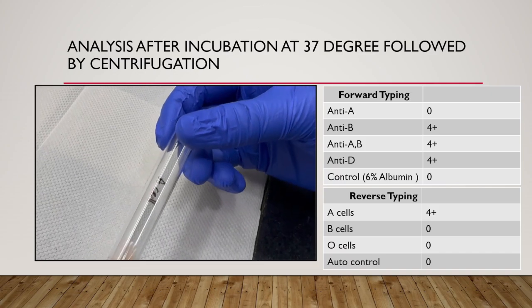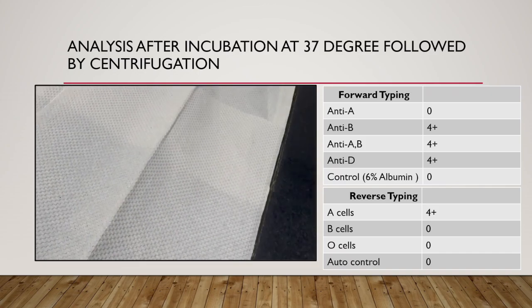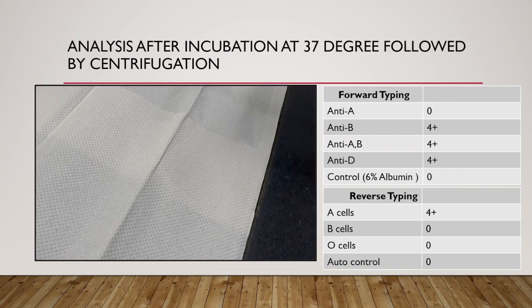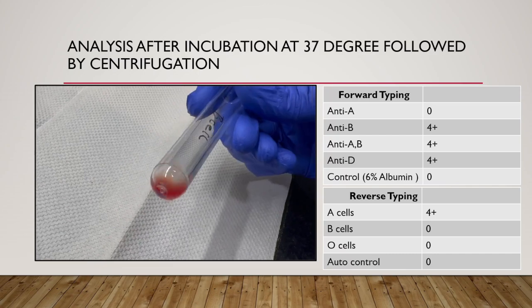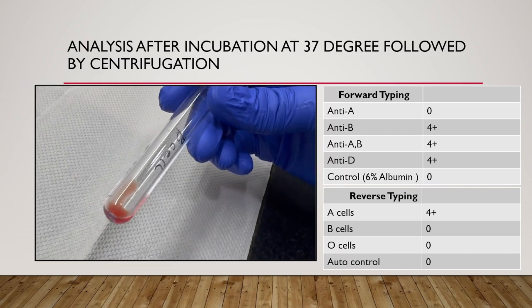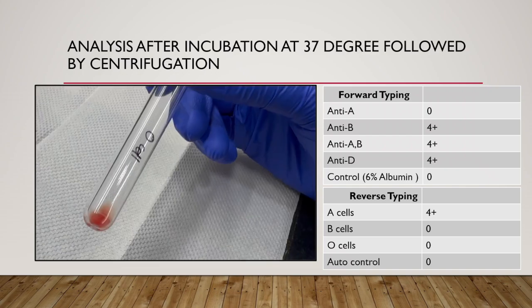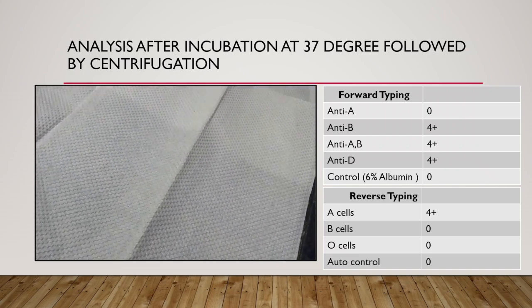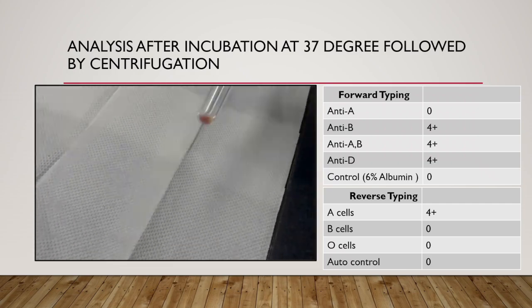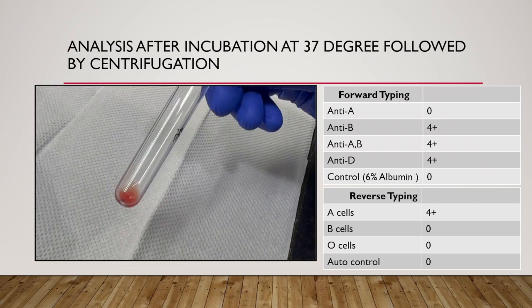Now we will be proceeding with the reverse grouping tubes. In A cell, we can see that the 4 plus reaction is there. In B cell, we had a 2 plus reaction at room temperature. Now the agglutination has been resolved. There is a negative reaction in B cell. In O cell also there is no reaction. And in the tube of autocontrol, here also there is no agglutination.